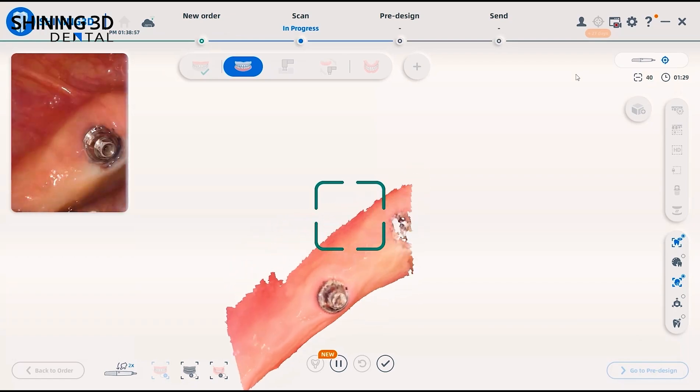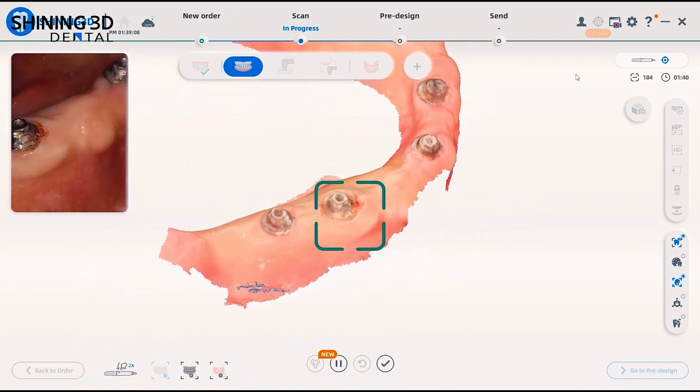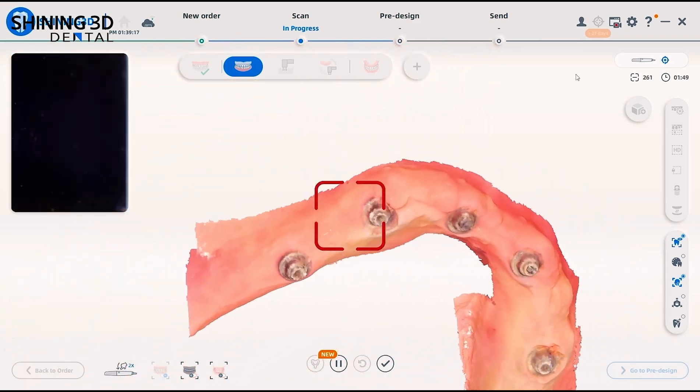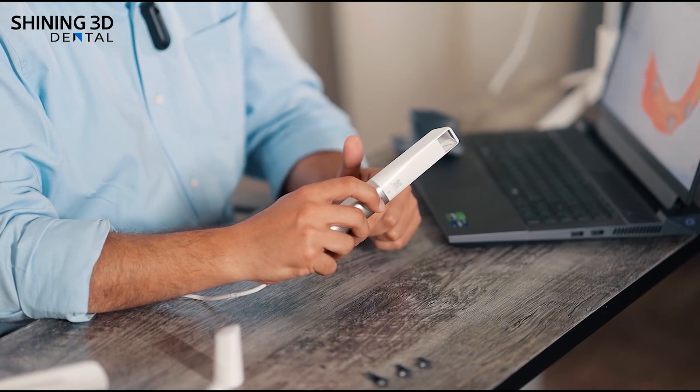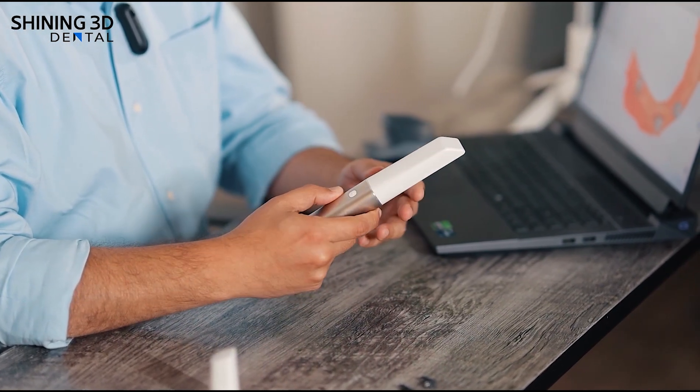Especially when doing edentulous cases — you can see now working in the background a scan for a mandibular patient, and you can see how fast the tracking of the scan is using this scanner. It's really very fast and very efficient, and you will be seeing a lot of nice results in terms of accuracy.